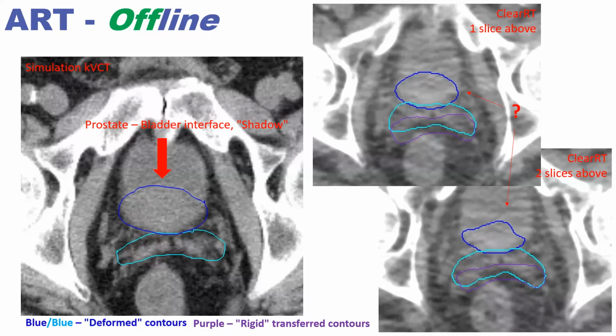So here you go. This is for the MR guidance. Yeah, you could probably define this much better, but there's a limit that we're dealing with. Does this matter? Should we include this? Should we not include it? It's very hard to tell if that's actually it, or is there's a beam hardening artifact between the femurs due to that, which is something we tend to see.